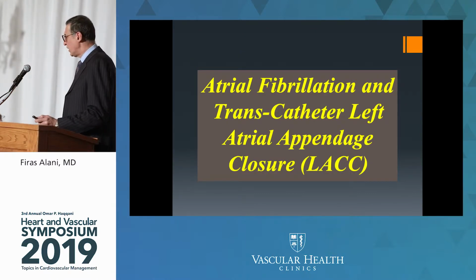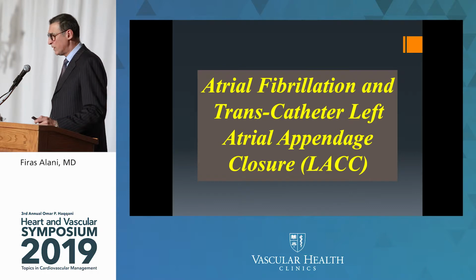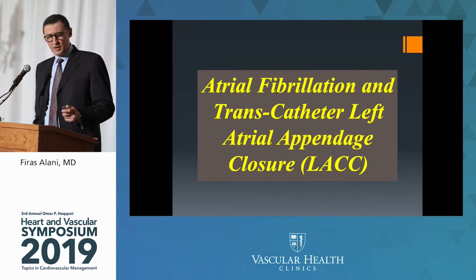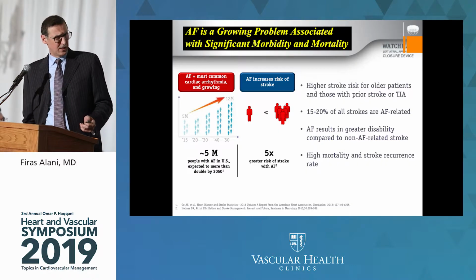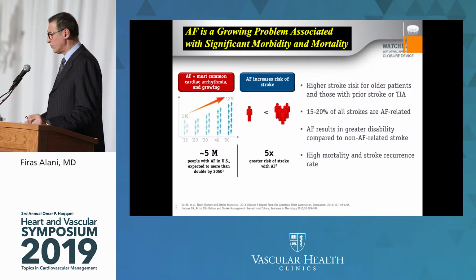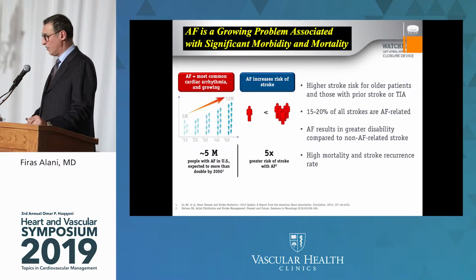I want to shift gear quickly and talk about Watchman, and then maybe we can open the floor. I don't think we'll have time to talk about the mitral. Again, the Watchman is a device that's offered to those patients who have atrial fibrillation, who cannot take anticoagulation.